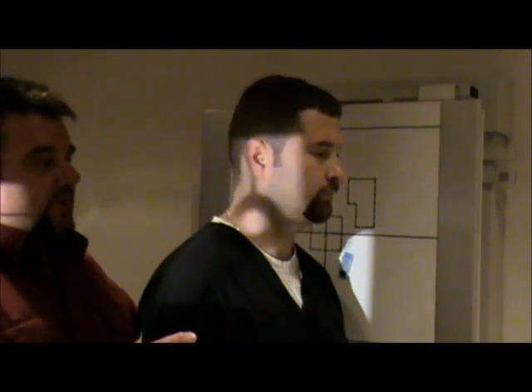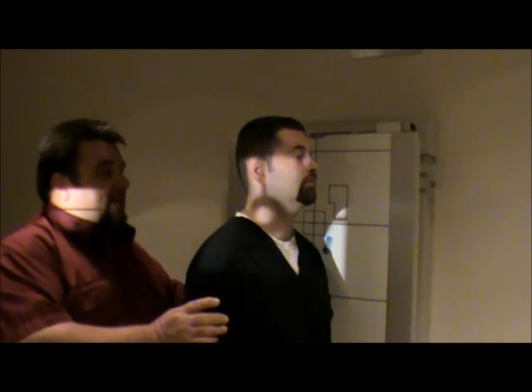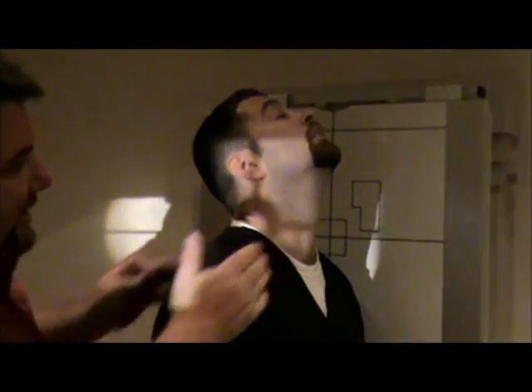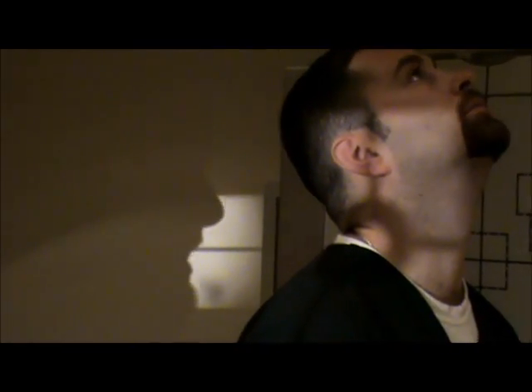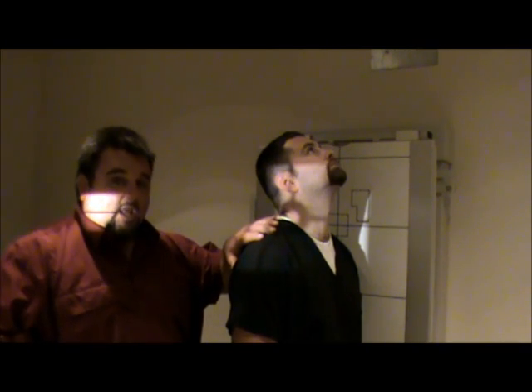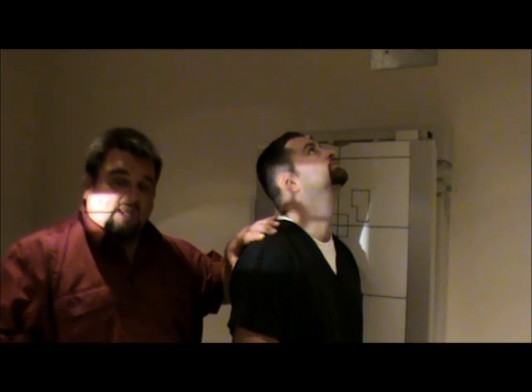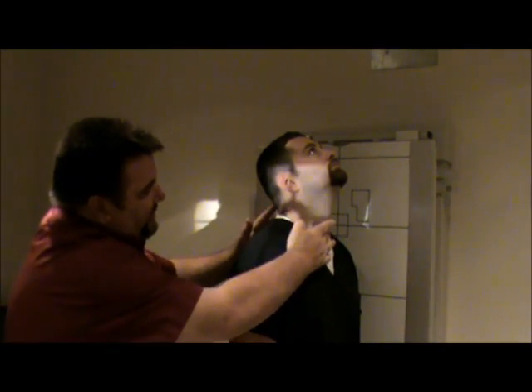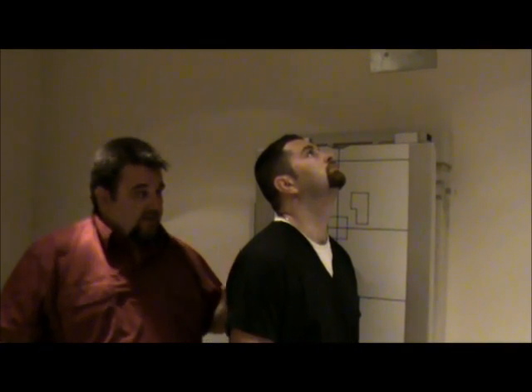We're going to have the patient stand back up and put their head straight. The next view is extension — the patient brings their head back as far as they can. We'll bring the patient forward slightly to get centered back to the film. We're going to move the marker to the back, because that tells us when reviewing the film that this was the extension view. Many patients cannot extend very much, so it's very difficult to tell between flexion, extension, and neutral — marker placement distinguishes them. Centering is still behind the ear, film size is 10 by 12, and technical factors remain 77 to 81 kV.